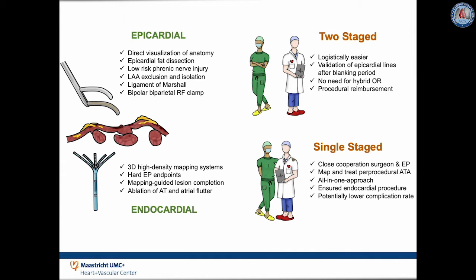We in Maastricht perform the single-staged approach, and we favor this because it's an all-in-one approach. It allows close cooperation between the surgeon and the electrophysiologist. If there are atrial tachyarrhythmias that occur during the procedure, you can map and treat them at once. You have an ensured endocardial procedure and a potentially lower complication rate.